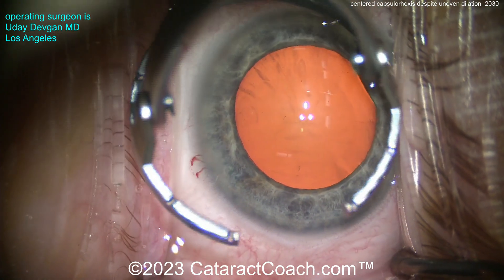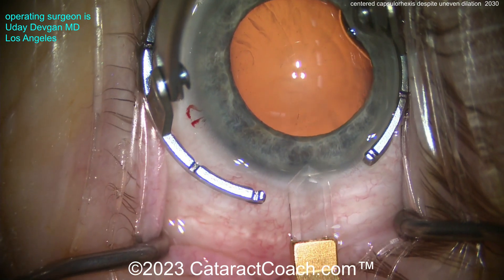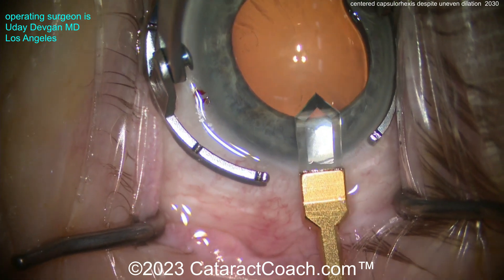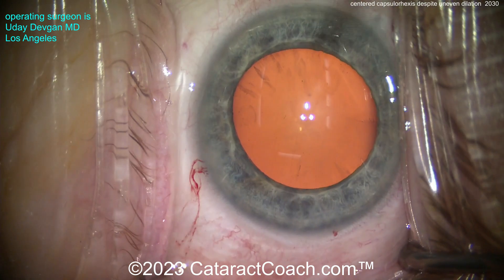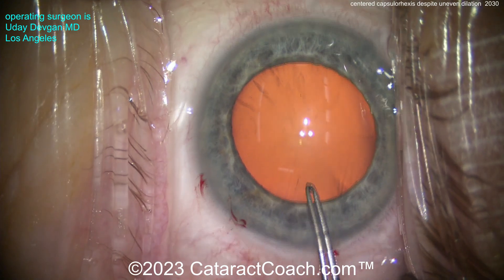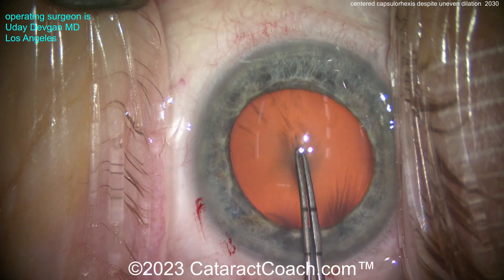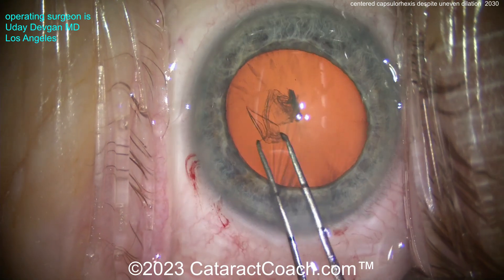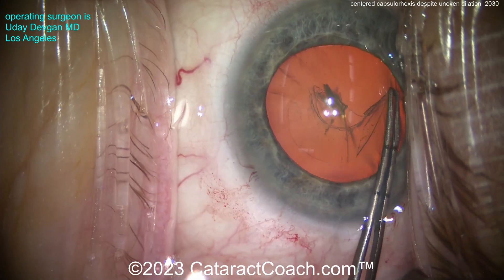That's going to be pretty easy, right? Well, not so fast. So we make our main incision here — here's the diamond keratome. This is a complete cataract case shown start to finish from the very first incision to the end of the case. You get to learn by seeing the whole case; don't worry, it's only five minutes. Now going to start with the capsulorrhexis forceps. Look what happens — there's just some asymmetry there. I'll start the rhexis here, poking in. And now look at the top right of your screen: that pupil's coming down a little bit, it's not so symmetric.